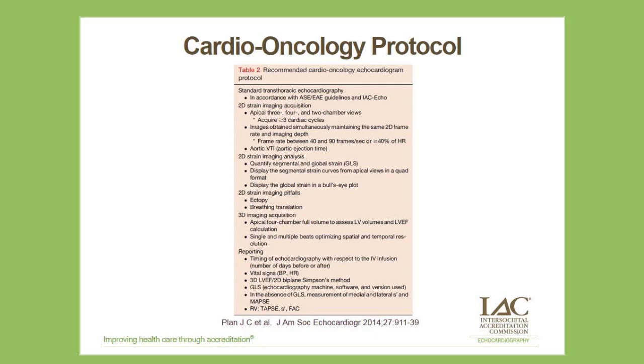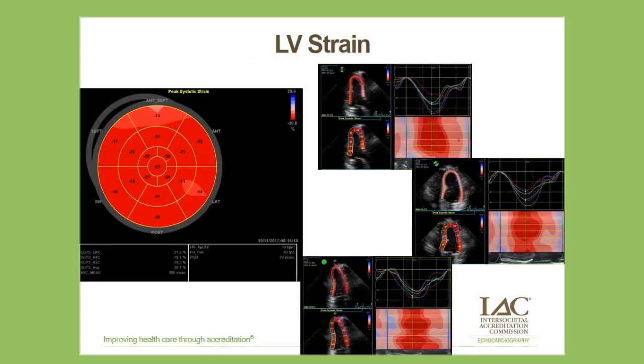So reporting, there's a list of things that should be reported with these patients, especially their vital signs and other things that are listed here. Okay, so here's an example of a patient that had strain performed.